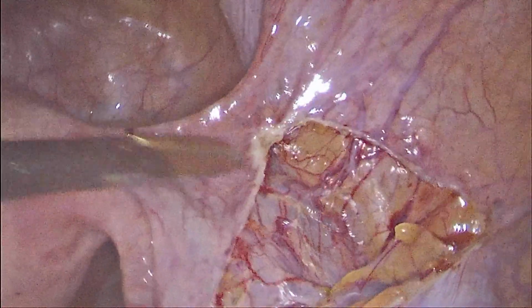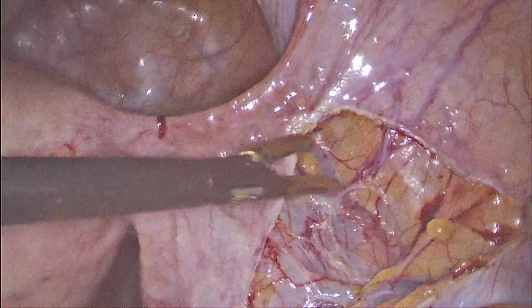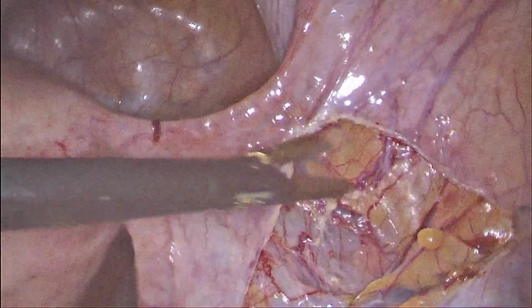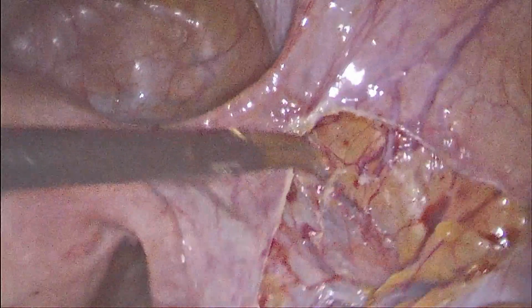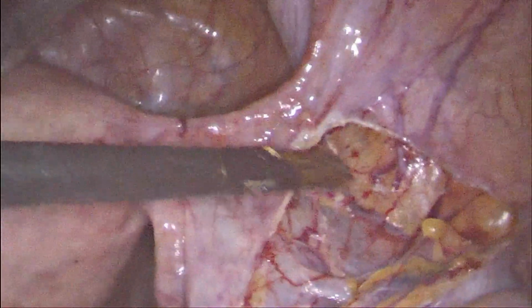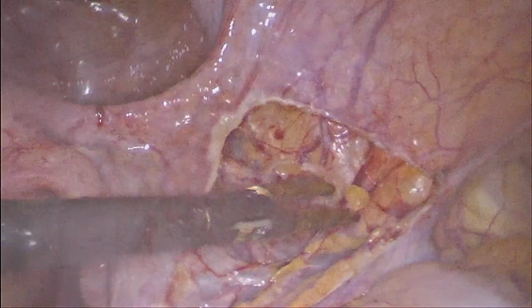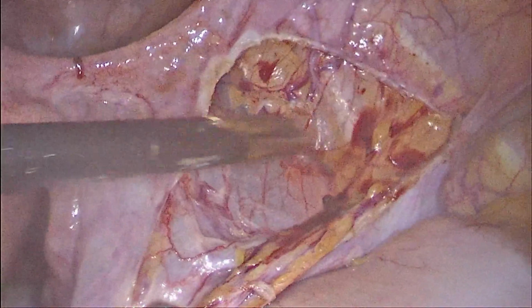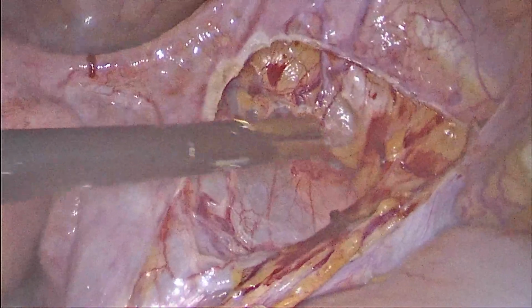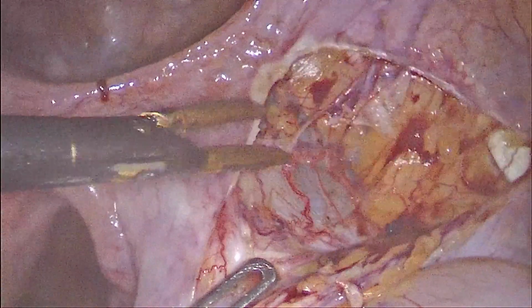The dissection is continued further parallel to the infundibulopelvic ligament to identify the uterine artery. First, we have to identify the ureter, and then we can continue the dissection anteriorly, where we can see the uterine artery crossing the ureter from lateral to medial side.